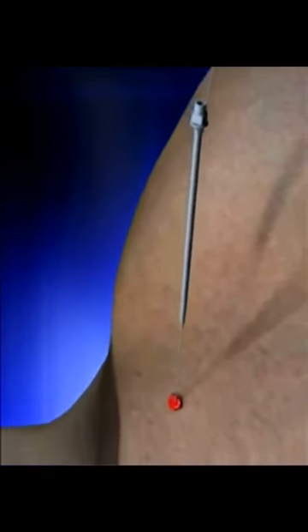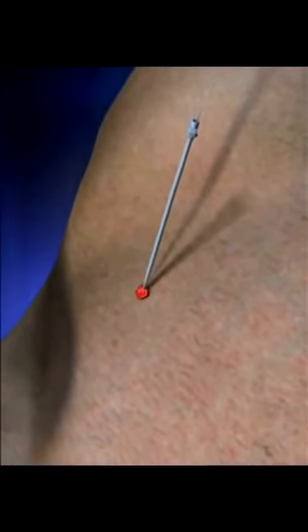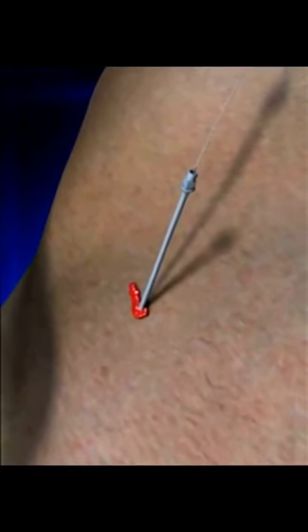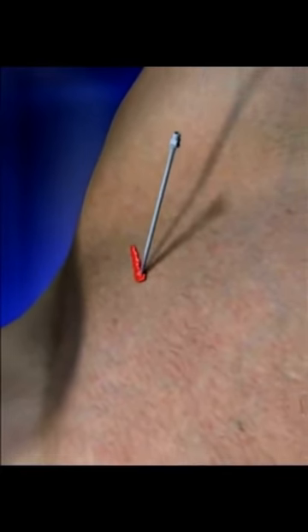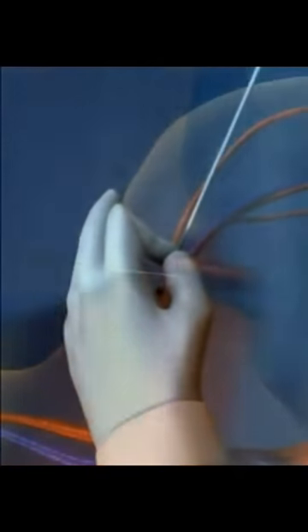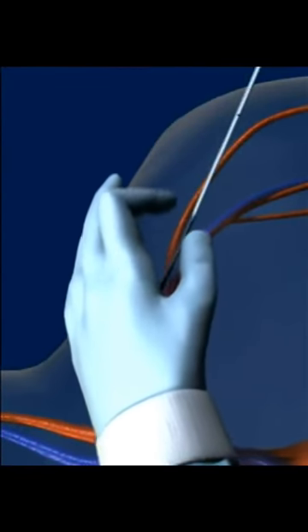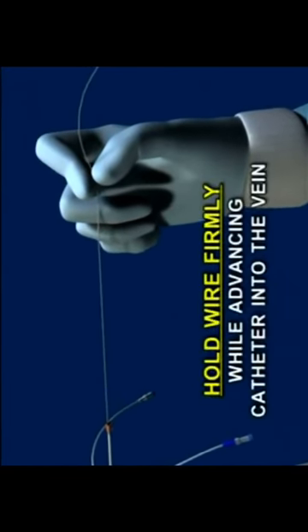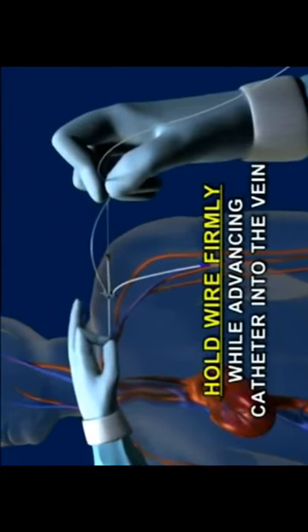The dilator is then used to dilate the track where the catheter will be placed. There will be increased bleeding after dilating, so gentle pressure at the insertion site is often helpful but not required. The catheter is then threaded over the wire into the vein. It is extremely important that the wire be advanced all the way out of the catheter until it exits from the brown hub before beginning to advance the catheter into the vein. It is absolutely necessary that the wire be held firmly while the catheter is advanced to prevent the wire from being lost in the vein.